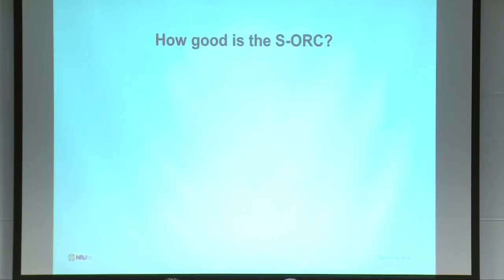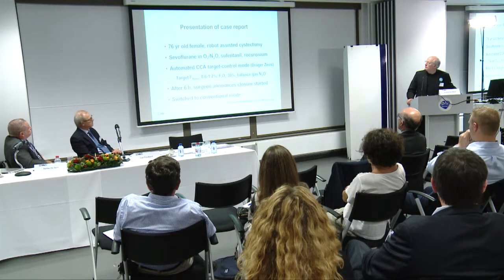So now the question is, how good is this S-ORC? Because to the best of our knowledge, this has never been tested before. The criteria, the thresholds, were chosen arbitrarily. So we don't really know how good they are. And the goal is really that these guards, the hypoxic guards, should prevent us from giving a hypoxic gas mixture to the patient. That should be very clear cut. So how effective are these guards?